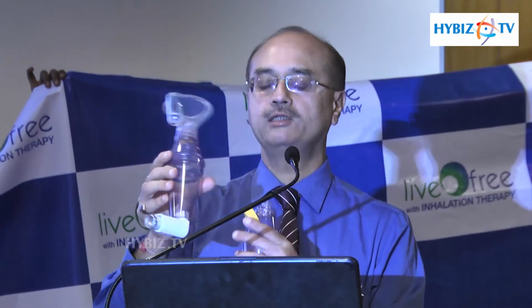In children, we have a spacer with a mask. We attach a mask in small children and press the spacer. So that is the difference. Must take the preventer inhaler regularly, reliever inhaler only when required.